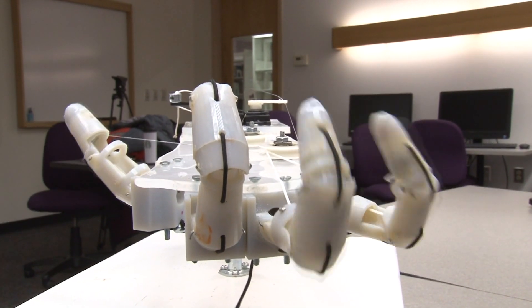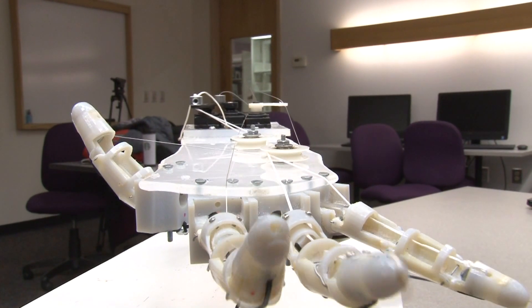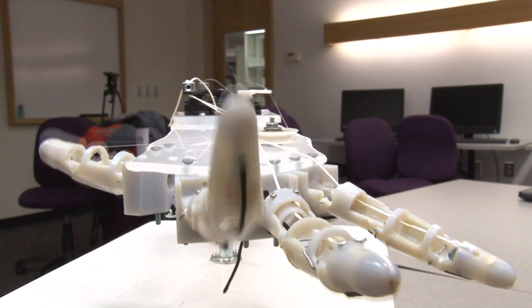I've always wanted to build a robotic hand, and two years ago I had an honors student come to me and say that she wanted to build a hand. So we applied for some institutional grants, got the grants, and the rest is history.